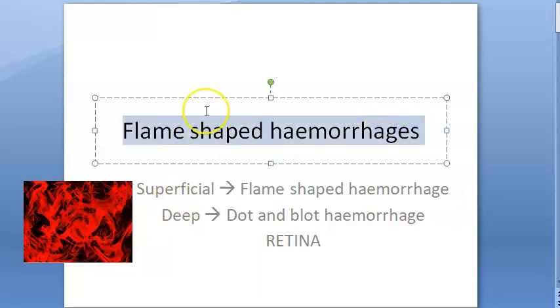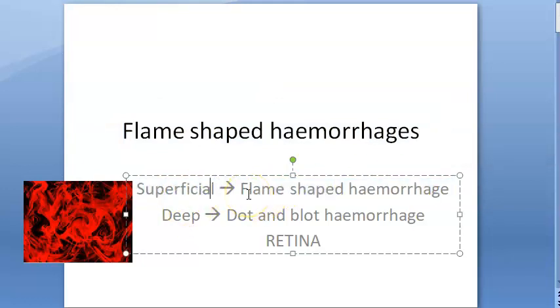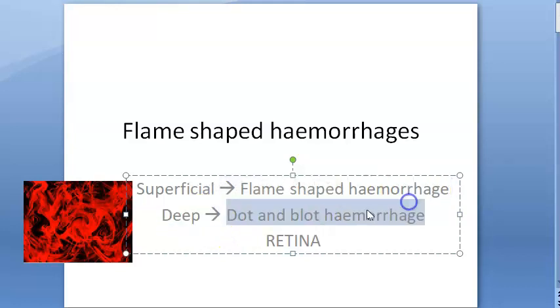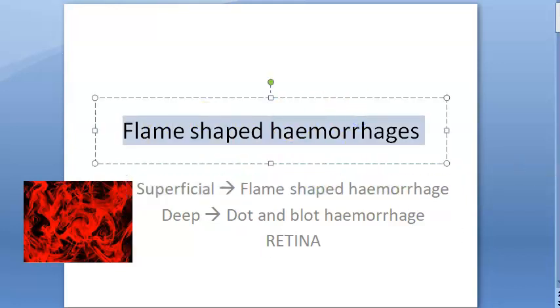In the retina, you can see flame-shaped hemorrhages in many conditions. Flame-shaped hemorrhages are superficial hemorrhages — that's why they look like flames. If it is a deep hemorrhage, you will see dot and blot hemorrhage. We are looking at flame-shaped hemorrhages, which are superficial, and we'll go through all the conditions where you can find them.